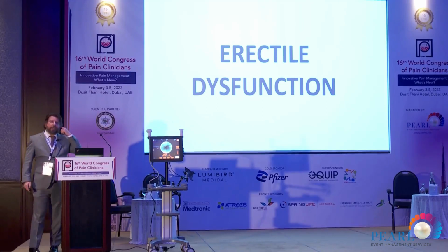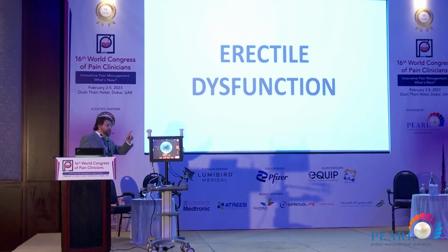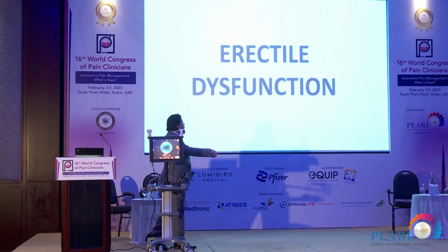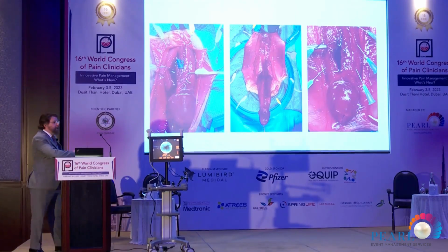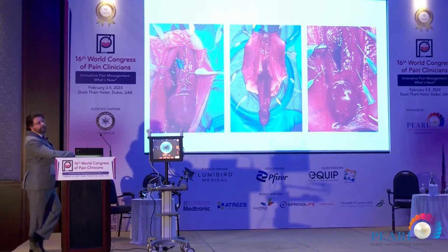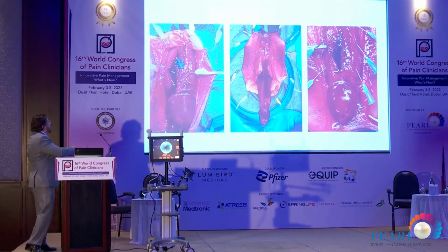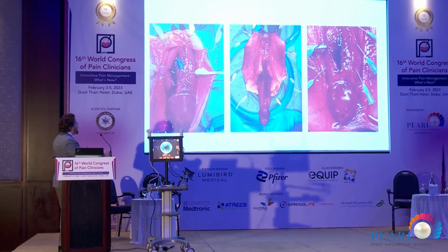We want, in the next month, in March of this year, to use for the first time this machine for erectile dysfunction. This is in cadaveric. I have one protocol that is similar to the P-Shot in the United States, but in Spain, the name is Human Protocol, and I put stem cell or PRP after the shock wave for erectile dysfunction, for the patient that suffers chronic pelvic pain, for the men.